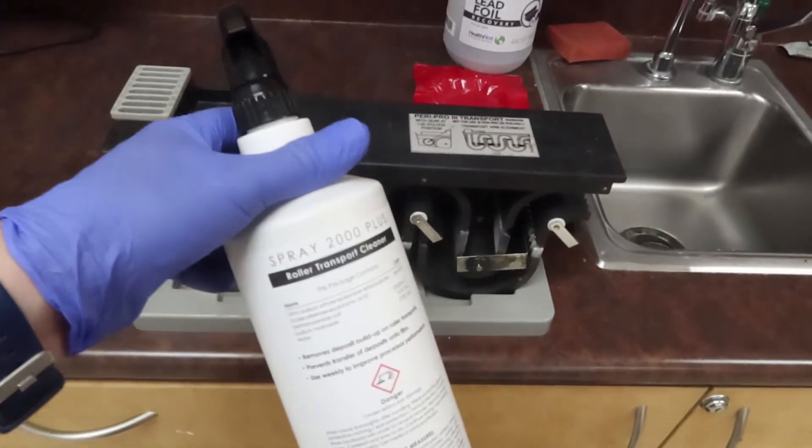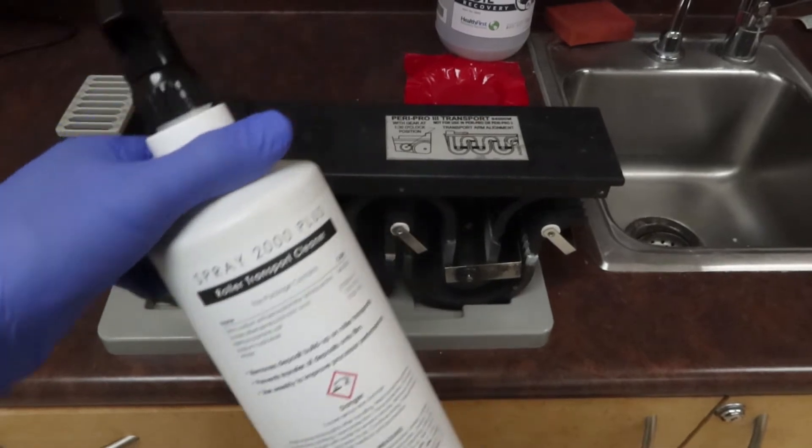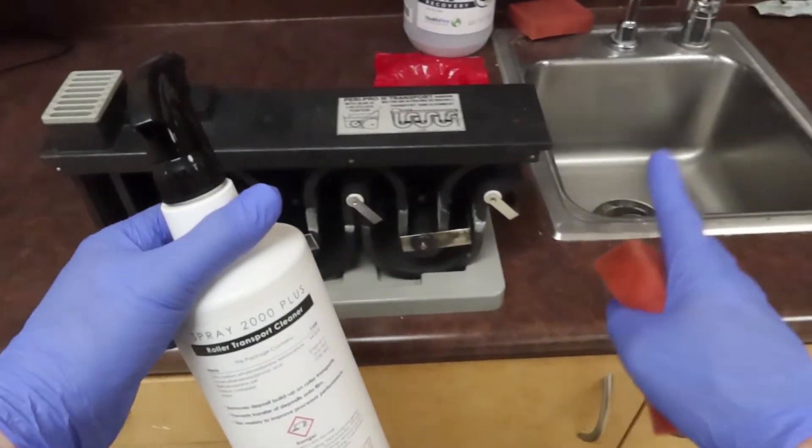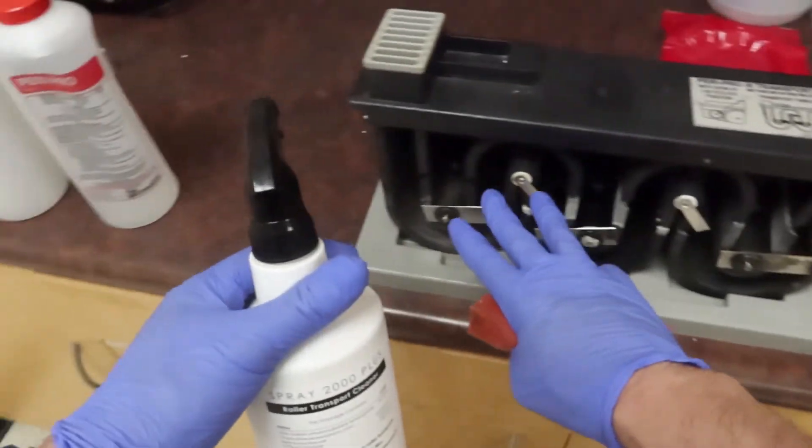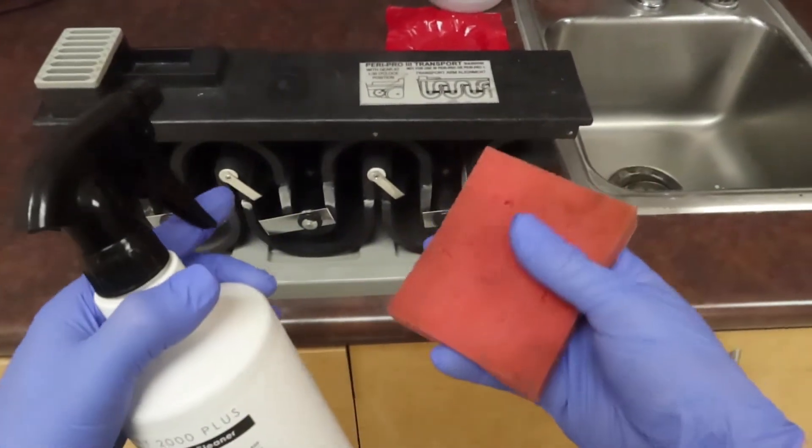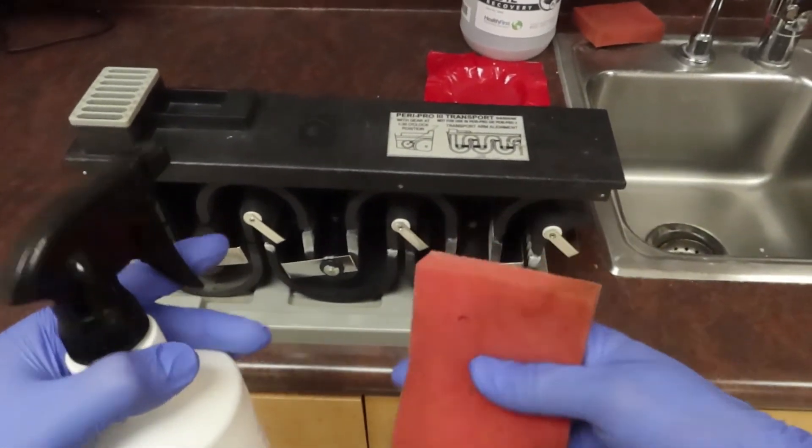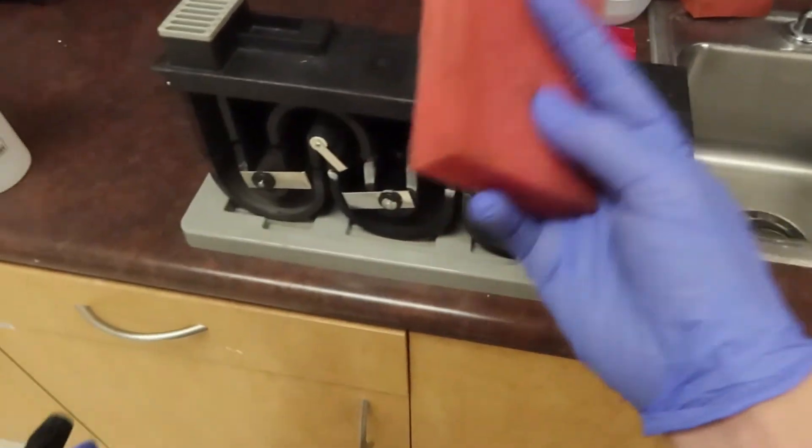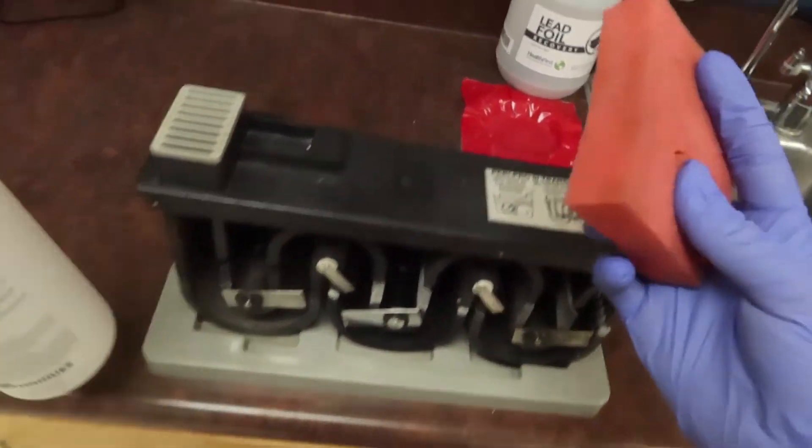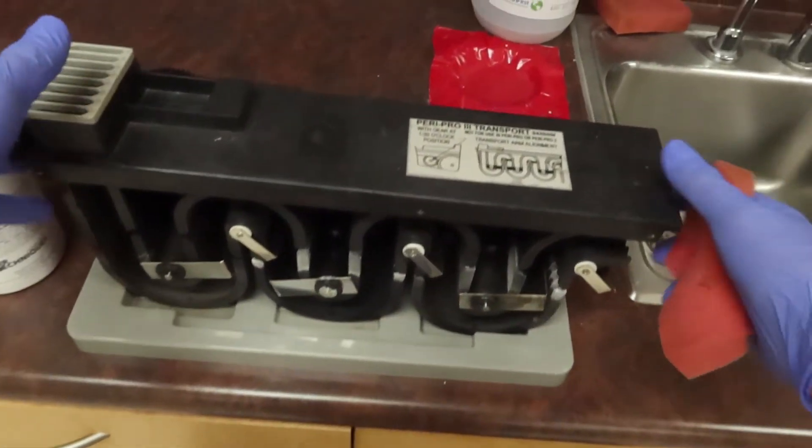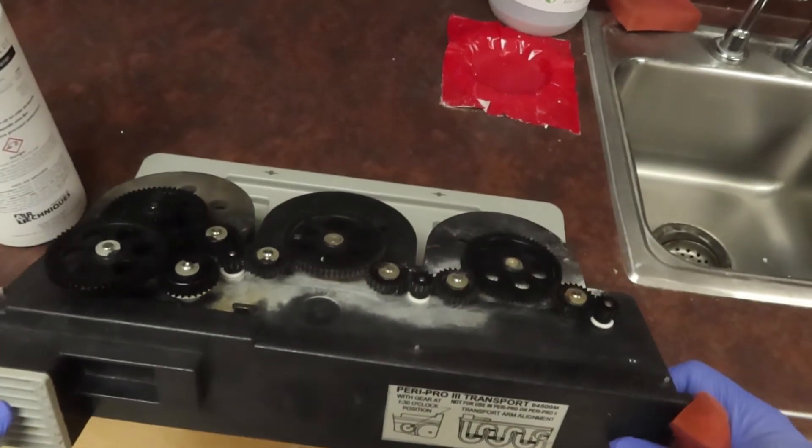The proper equipment that we're going to clean this out with is the Spray 2000 material that's going to get all the fixer, developer, and all that gunk out of this section, because we don't want any of this residue to transfer onto our films and give us a bad time. That, along with a nice non-abrasive sponge, is going to clean all the rack on the inside and clean the gears on the back.